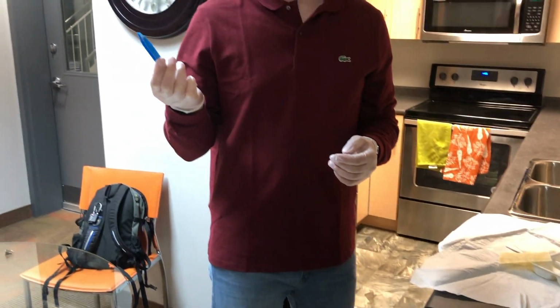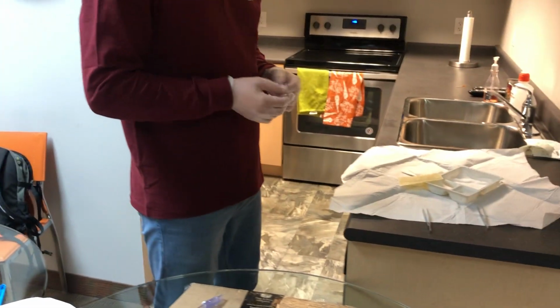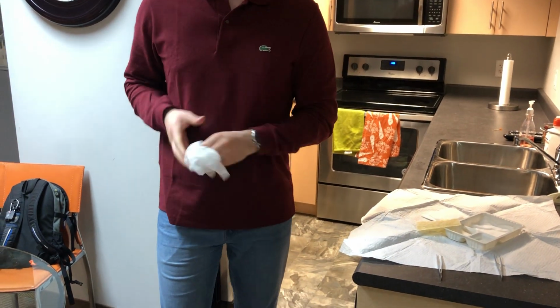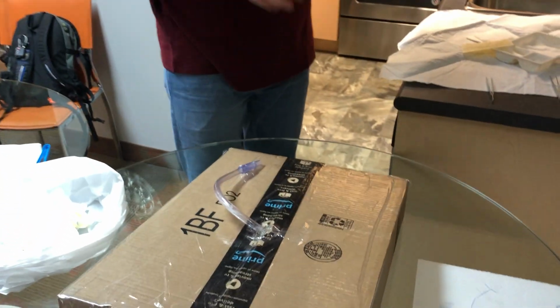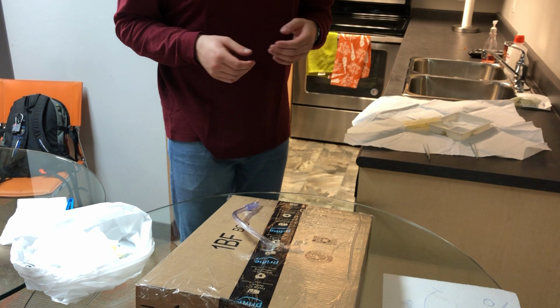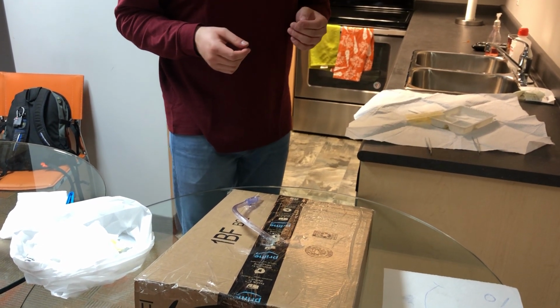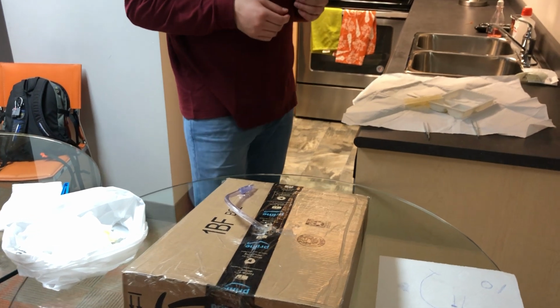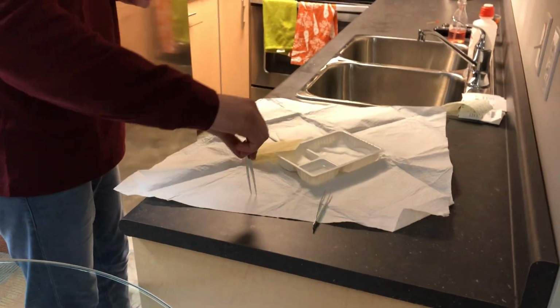We can discard these forceps because they've been contaminated, so I put that in the sharps bin. Okay, I remove my gloves. Perform hand hygiene. Now I can inspect the site. There's no emphysema, no erythema, there's no redness, the sutures are intact, the tube is intact, there's no signs of air leak, and it's a very healthy and intact site. Okay, so then we can begin actually cleansing the site.